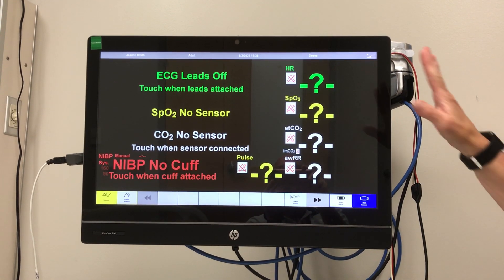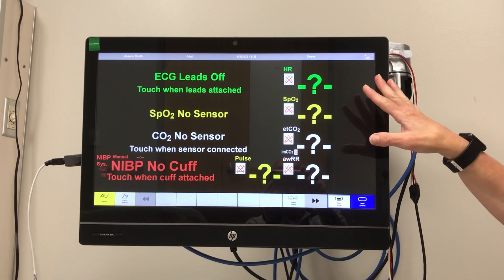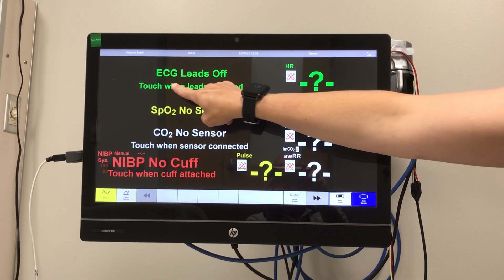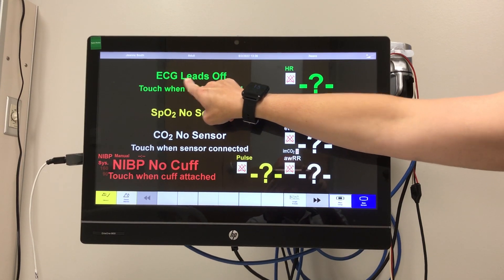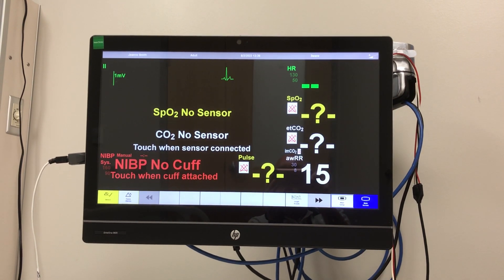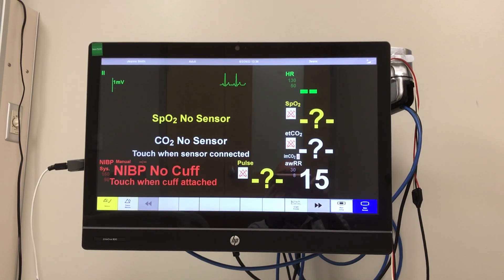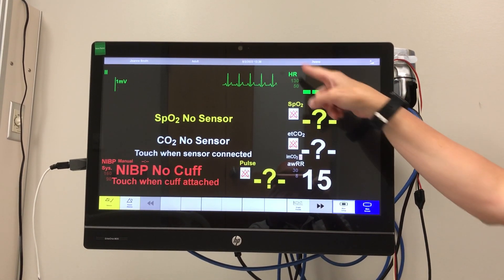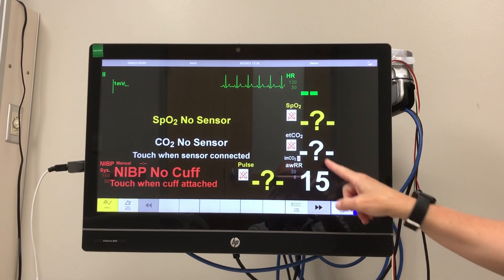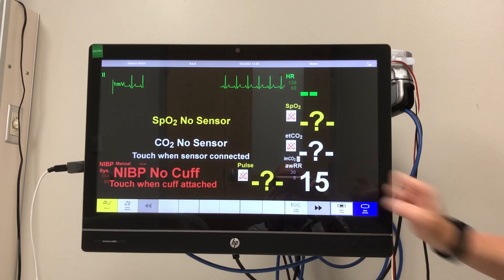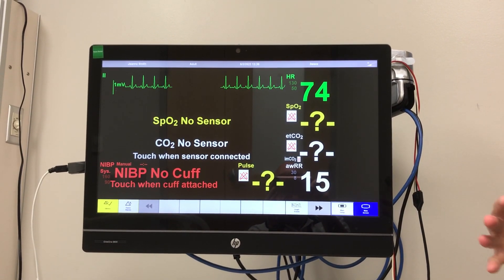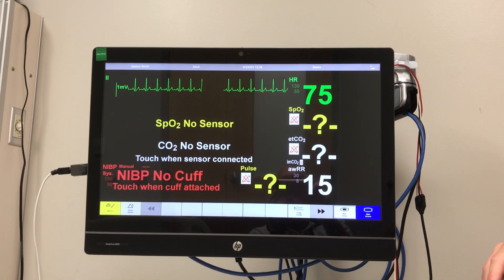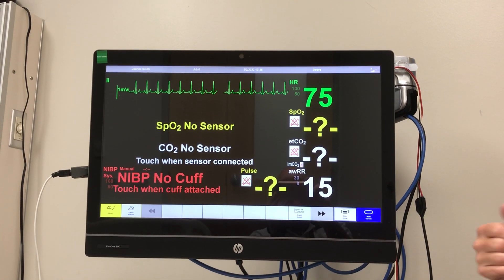Once you attach the ECG leads to the chest, you then touch 'leads attach.' When you touch there, you're then going to get an ECG tracing. When you get the ECG tracing, you also get a respiratory rate based on the rise and fall of the chest and the leads.